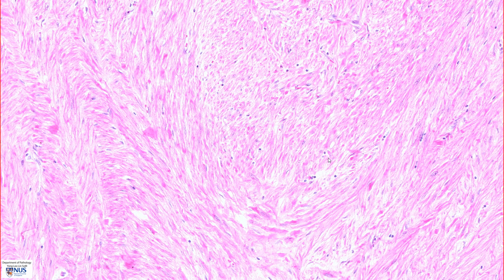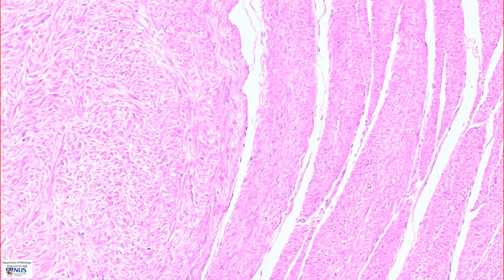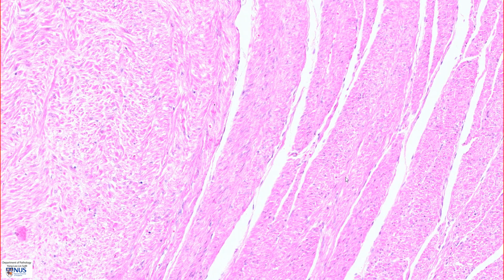So this is an example of a leiomyoma. It is a benign smooth muscle tumor arising in the wall of the esophagus. The cells of this tumor look virtually identical to the cells of the benign smooth muscle that makes up the muscularis propria. Let's learn a bit more about esophageal leiomyoma.